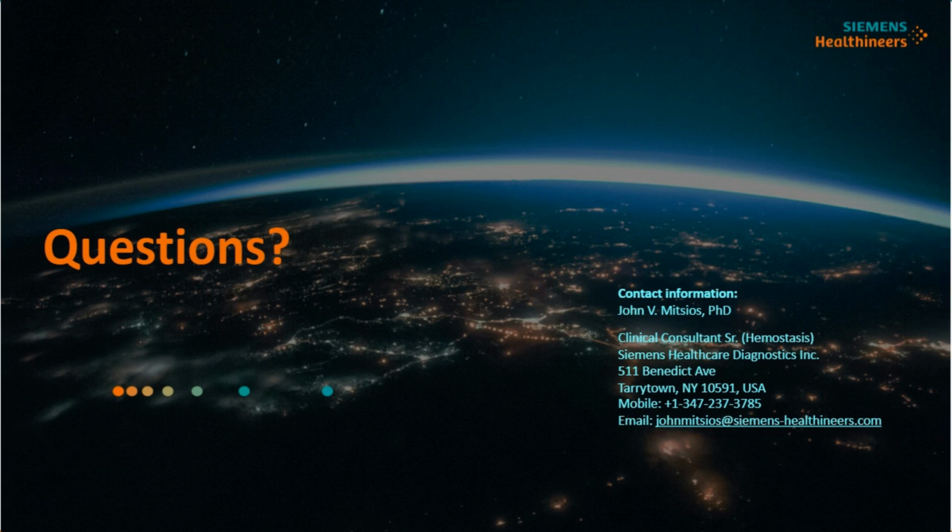So again, I think this is a loaded question and also a difficult question to answer, because remember, when any ultracentrifugation techniques are performed, you also have to have the pre and post. So in the event of a highly lipemic sample, the recommendation would be to ask for a fasting sample that you're able to draw when the patient is free of these lipids.